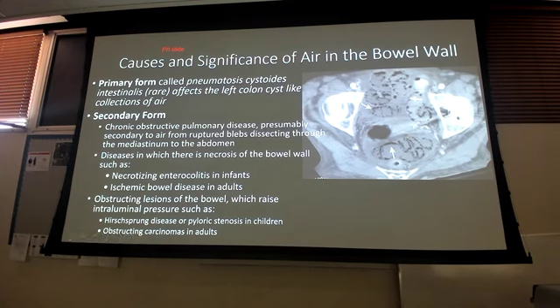Hirschsprung's or pyloric stenosis in children is one kids are concerned about. Again, you will learn that in peds and GI. I'm not going to test you on it, but when you get there and you happen to see a CT image with that kind of air, that's what this is.